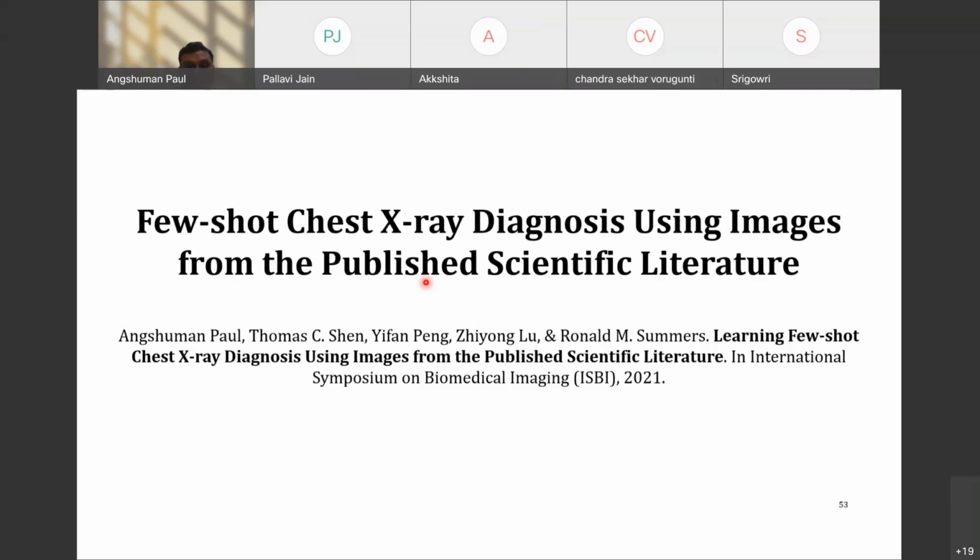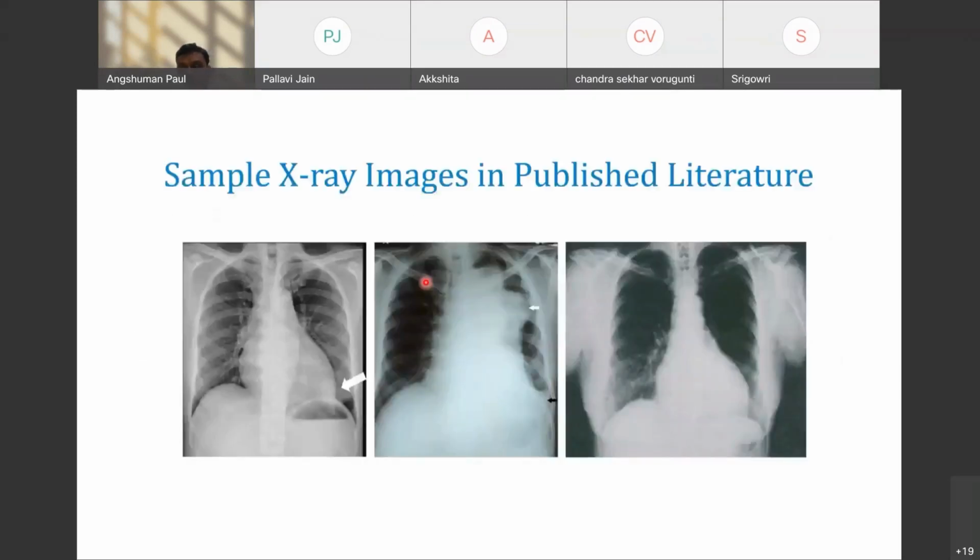This is often what a radiologist or any other field expert does by reading journal papers and looking at the images, they try to learn. And they use their previously learned concepts in this new learning. So we tried to mimic this exact same learning process in our few shot learning framework, but we tried to design a method from the published scientific literature.